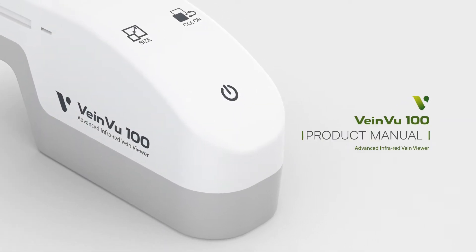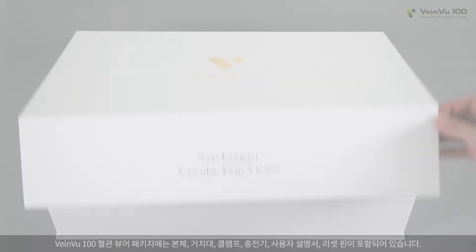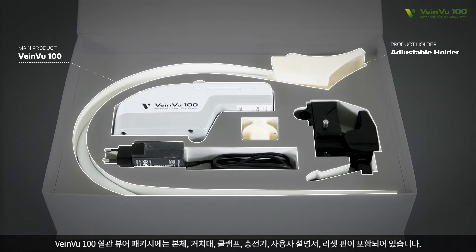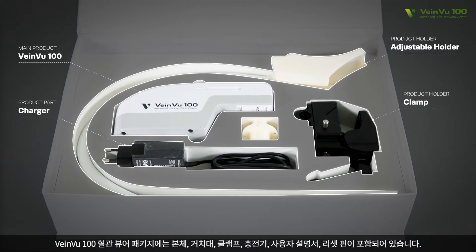Product Manual. VeinVu 100 vein viewer package includes main device, adjustable product holder, clamp, charger, manual, and reset pin.